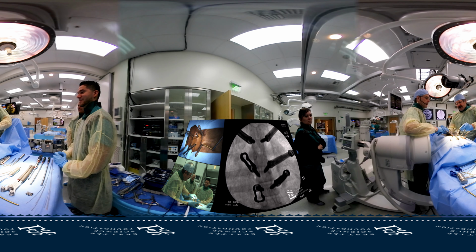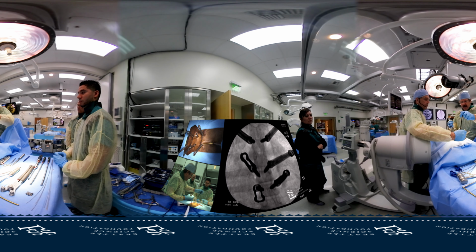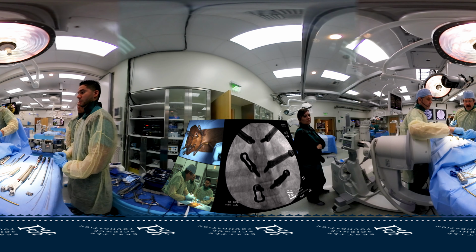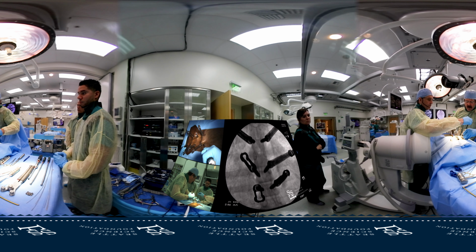So I drop this down once I think I'm through. And if I move my rod up and down, you can see how it moves the black tool up and down. If I'm not in the screw and I move my rod, you can see the black thing doesn't move. So I'll put it in, verify it's through one, and then I'll grab a hold of the next screw. Same thing, I can feel it. And go ahead and check that one. And again, you can see I'm through. Then I'll work it to the next one, again, just feeling it. Check that one, I don't think that's through. Okay, so that one's not through.